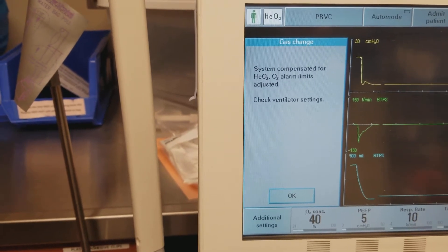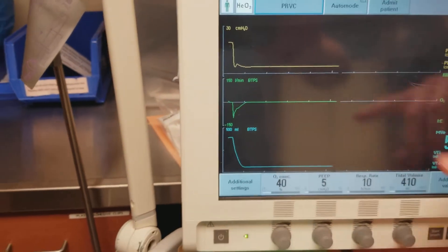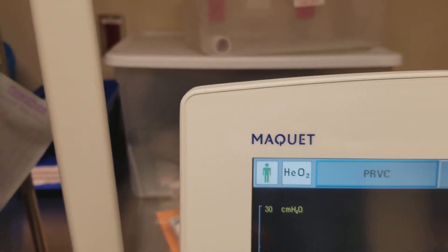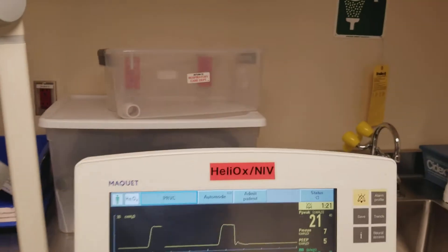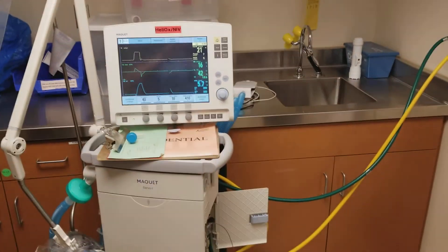Now it says the ventilator is compensated and to check our settings. Now that we've made all the changes, we do have an indicator up here that says helium is running through the ventilator, and now we're ready.